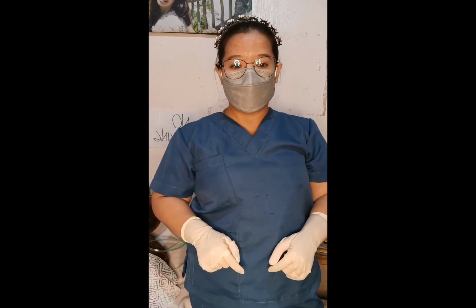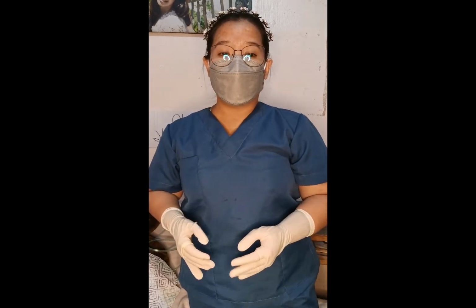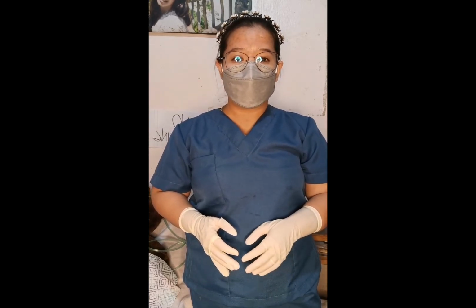So now, once we're done with the cannula, we will be using the mask type of oxygen. Now that we're done administering oxygen via the cannula, we will be doing another administering of oxygen via mask.